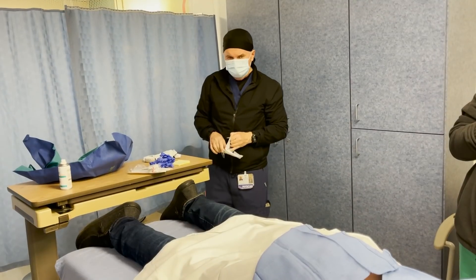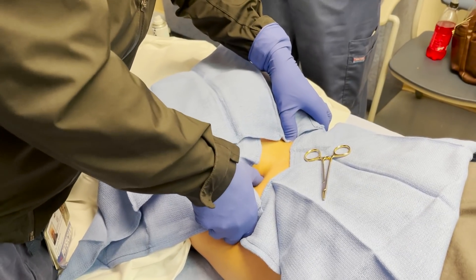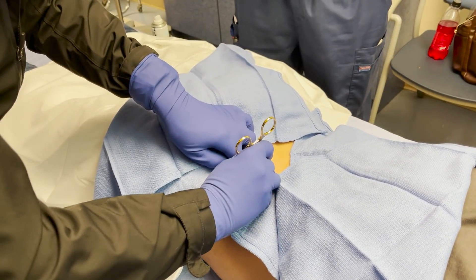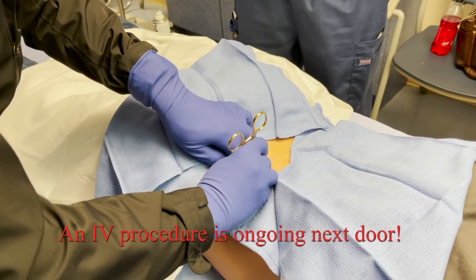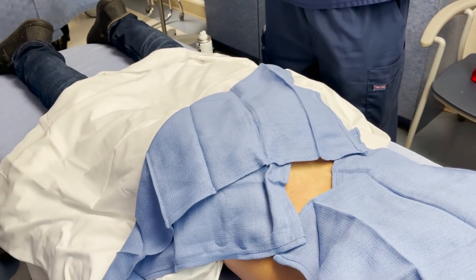I do have to mark my location. I think this is it right here — okay? I'm just going to put a little pressure on you right here. Okay, I've put a little mark there.